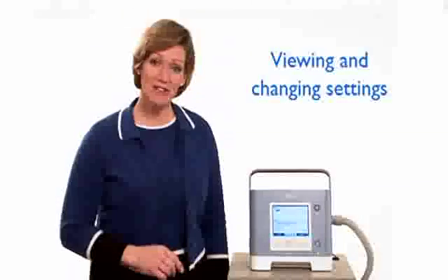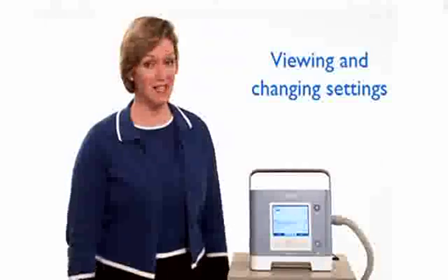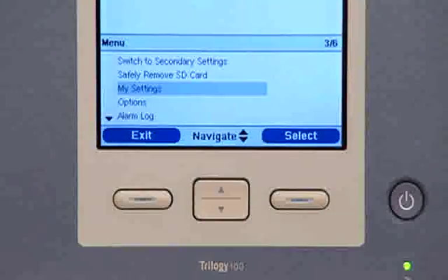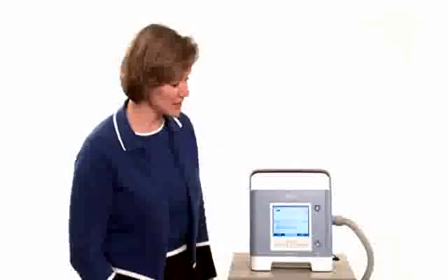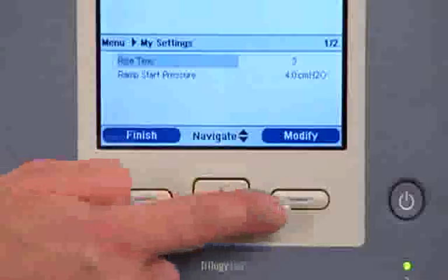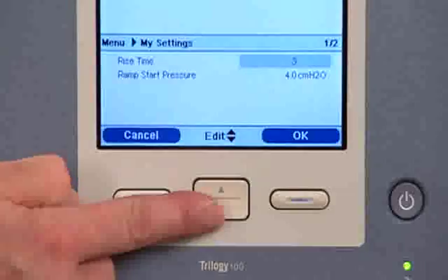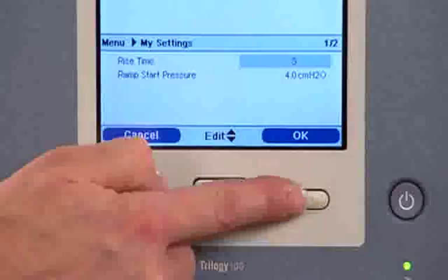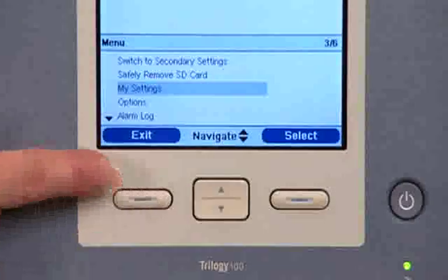Trilogy 100 allows you to view and change certain prescription settings if enabled by the home care provider. Use the up-down button to highlight the My Settings option on the main menu, then press the button under select. Use the up-down button to highlight the setting you want to change, then press the right button to modify it. Use the up-down button to scroll through available settings — press down to decrease or up to increase. Once you've chosen the setting you want, press the right button to save. You can then change another setting or press the left button to return to the main menu.